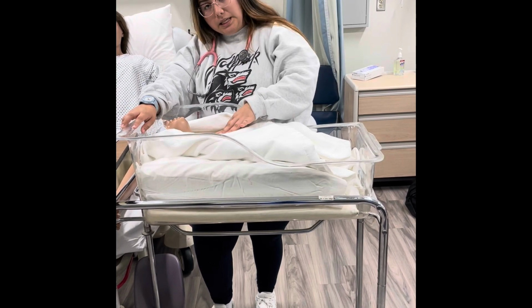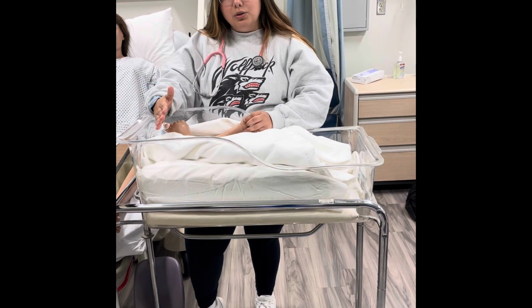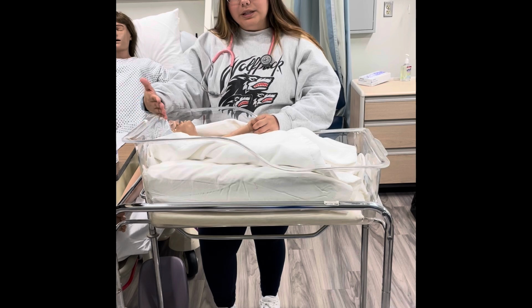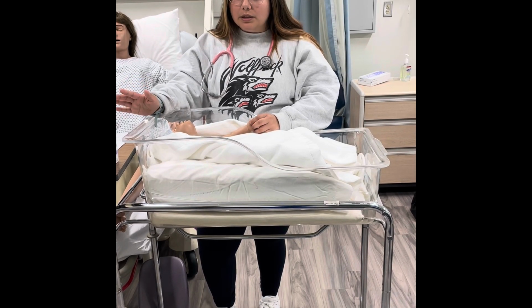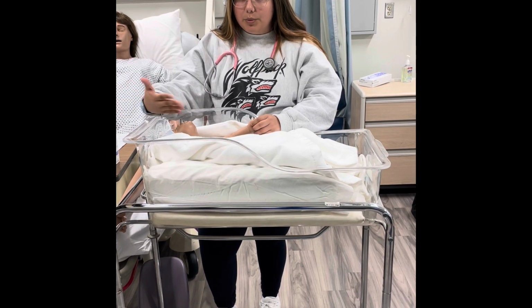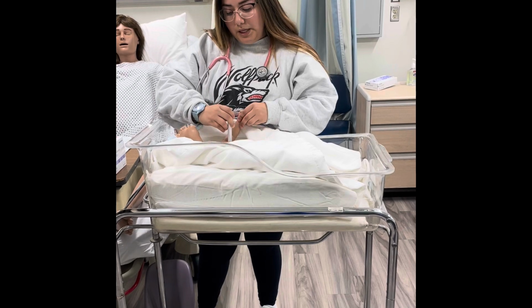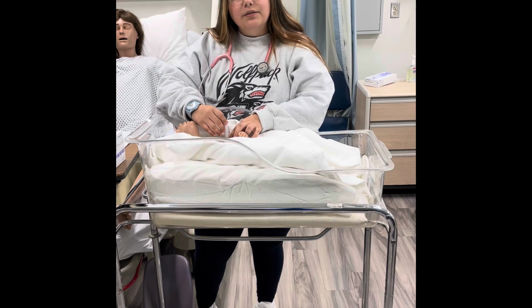I'm also assessing their skin. I want to make sure the respirations are between 30 and 60. If it's more than 60, it's probably because the baby is trying to compensate a little bit, breathing faster to get some fluid off. That's also more likely if the baby was at risk during the pregnancy or during the birth and labor. Now we're going to check their temp axillary, and it should be around 97 to 99.